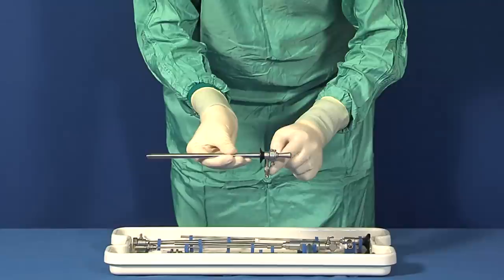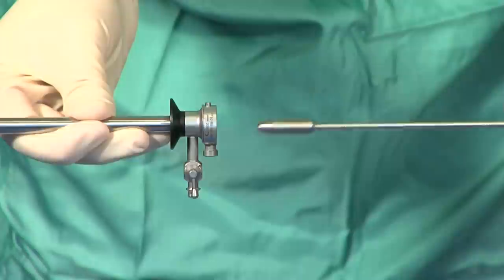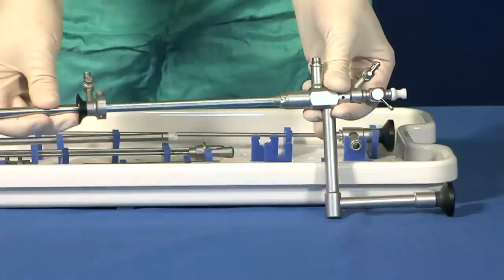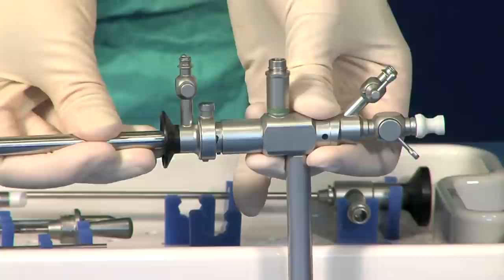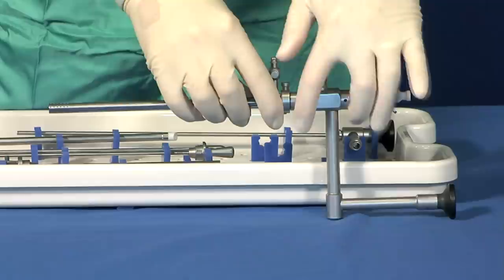Once the outer sleeve is positioned in the cervix, the obturator is removed by simply pressing on the quick lock connecting mechanism. The EOS hysteroscope can be easily attached to the outer sleeve by means of this ingenious connecting device. The quick lock system can be used, especially at the end of a procedure, for easily removing bits of myomas and polyps even more quickly than through the operating channel.